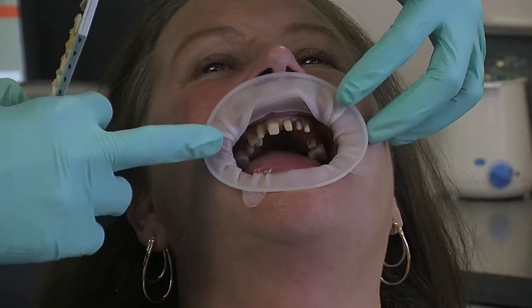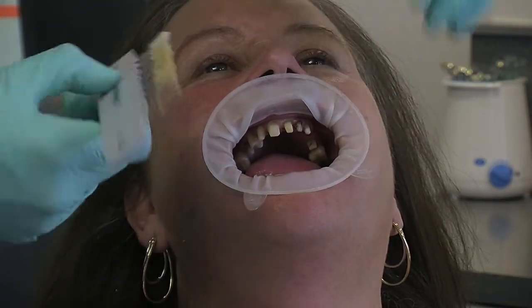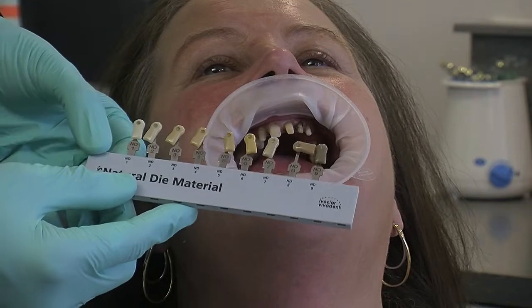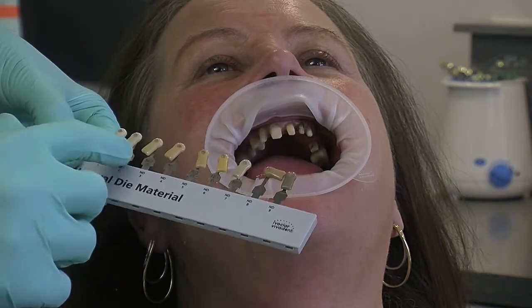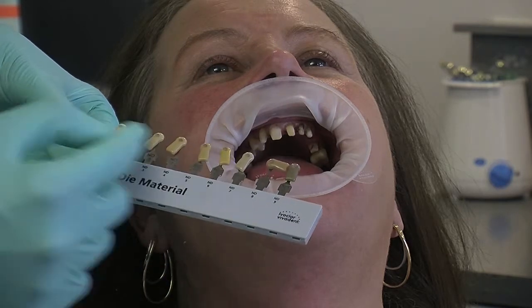The next thing I'd like to do is record these stump shade colours. We use a shade guide by Ivoclar called the Natural Die Material, labelled as ND1, ND2, all the way to ND9, lighter to darker.